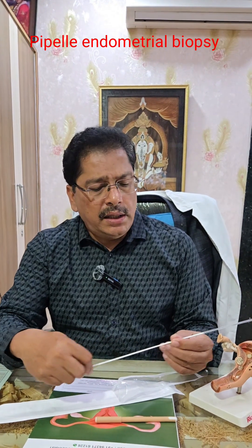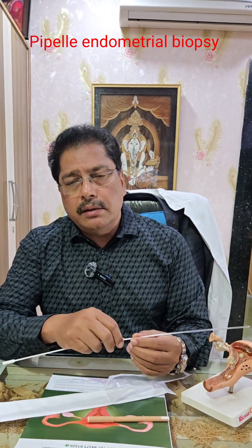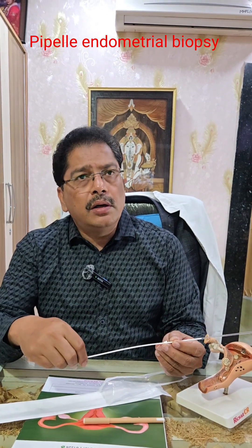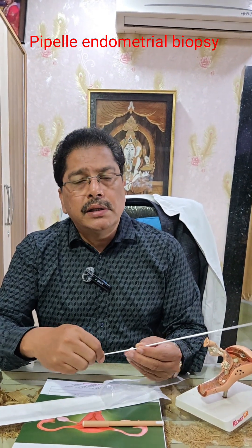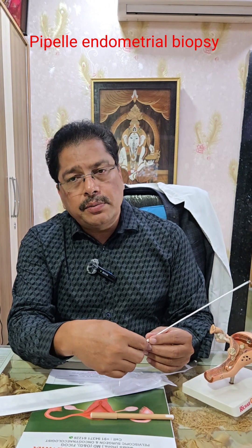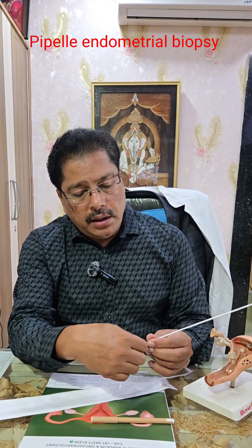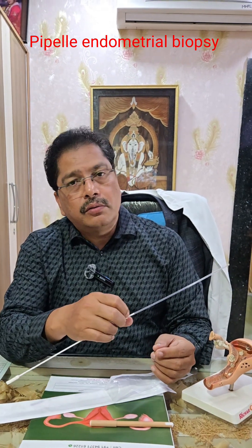This method is called the Pipelle endometrial biopsy method and is very convenient. The patient will hardly have any discomfort and can immediately go home. No antibiotic is required — only mopping of the vaginal canal and the cervix. Sometimes if the cervix is not straight, we hold the cervix and introduce the Pipelle cannula, withdraw it, and rotate two to three times.